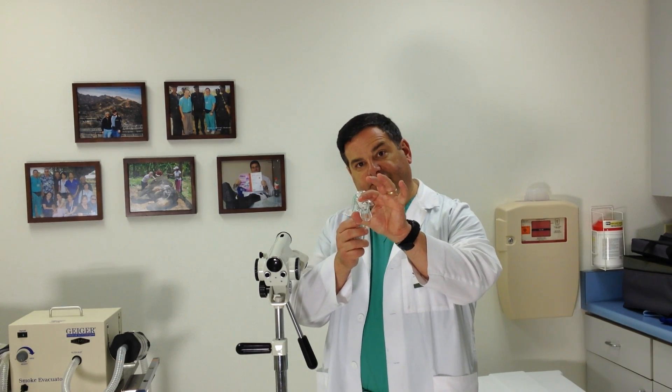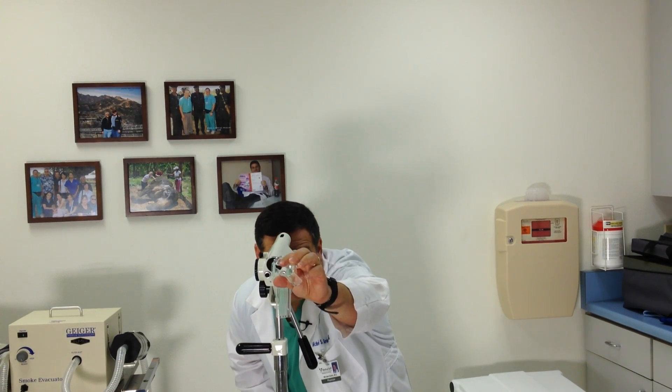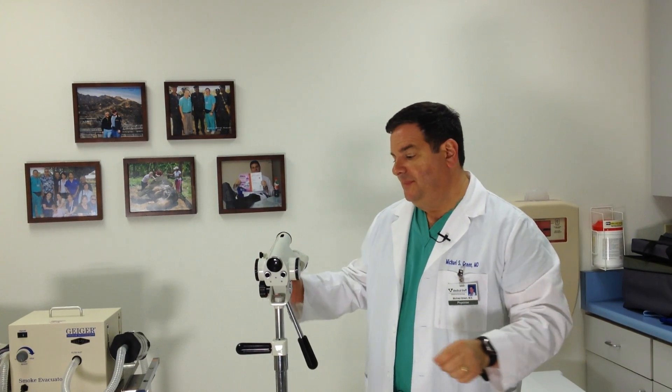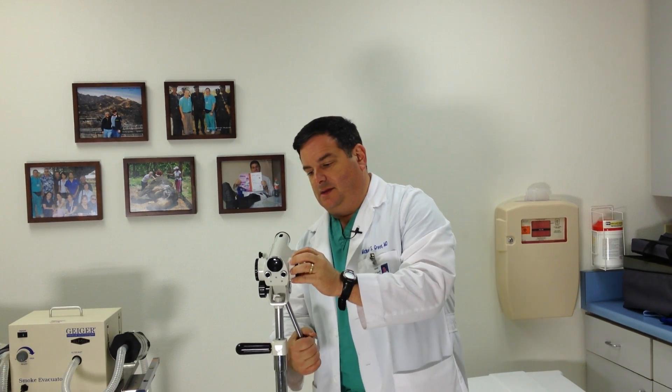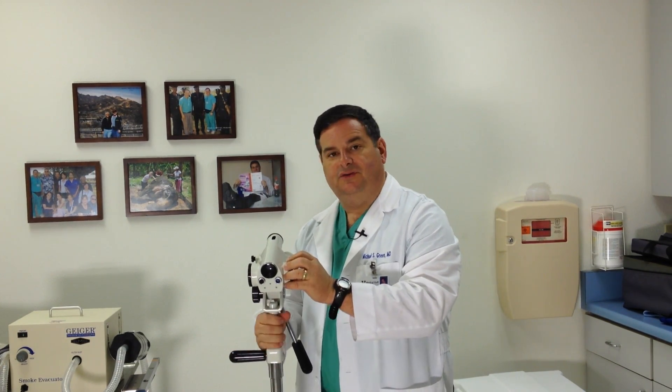What we do with a colposcopy is we put a speculum in, just like for a pap smear, and that's placed in the vagina. Then basically the doctor will come and look through the microscope through the speculum so that the doctor can see the cervix really close up. This has a little focusing adjustment here — you can move it back and forth, it also goes up and down, and we can adjust the magnification.